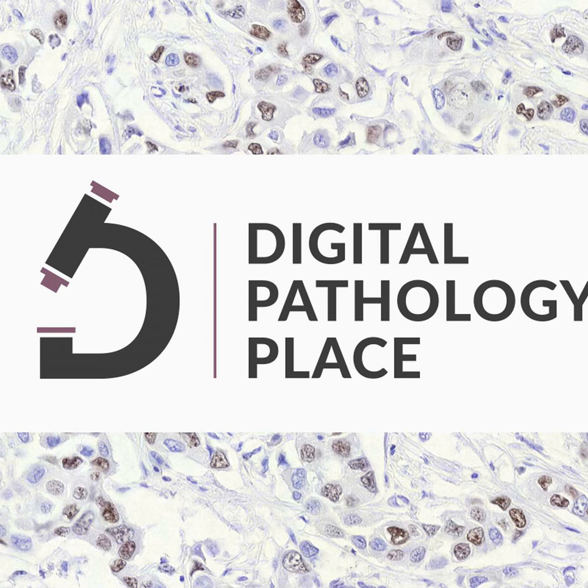So in Cytomine, the viewer is just a front end for your solutions. A Python developer, an AI developer just needs to have information, patches, mask, alpha mask, coordinates of annotations to train his models to be efficient.